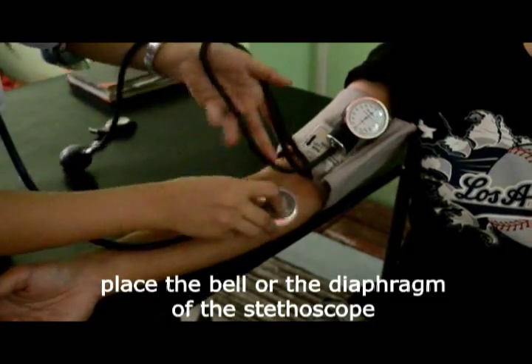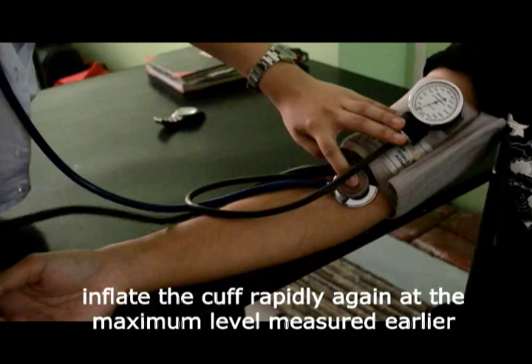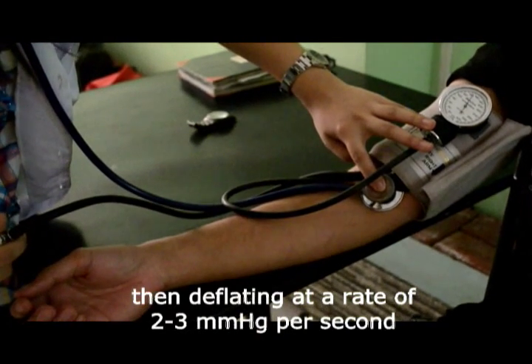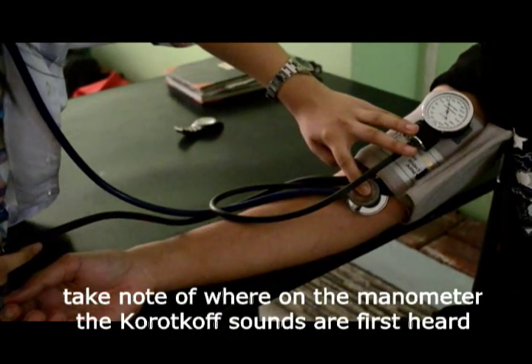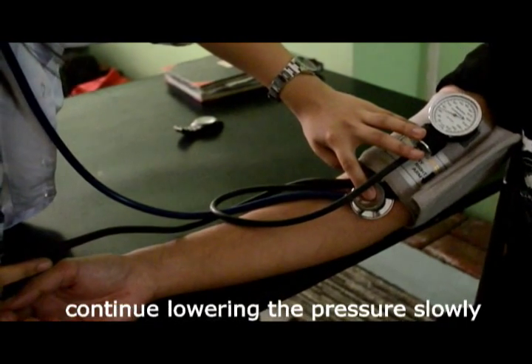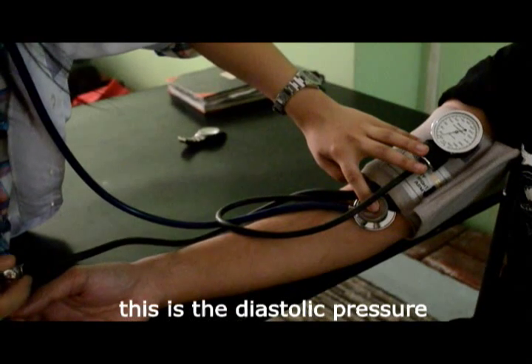Place the bell or the diaphragm of the stethoscope lightly on the brachial artery and avoid pressing on the artery too much. Inflate the cuff rapidly again at the maximum level measured earlier using the radial pulse, and then deflate at a rate of 2–3 mm mercury per second. Take note of where on the manometer the Korotkoff sounds are first heard — this is the systolic pressure. Continue lowering the pressure slowly until the sounds become muffled and disappear — this is the diastolic pressure.